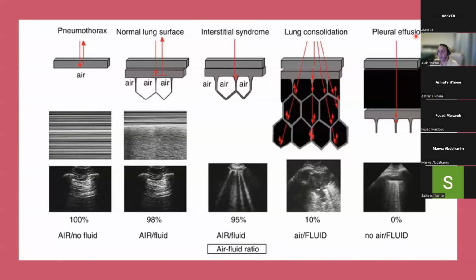I'm not going to talk about pleural effusion pneumothorax today, but what I'd like to talk about is just the last thing, and that's consolidation before we finish.